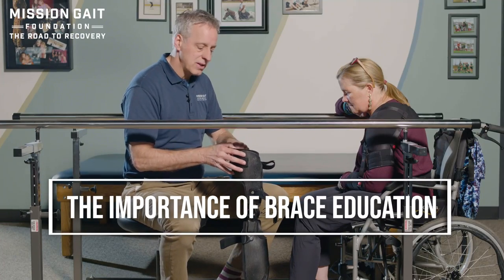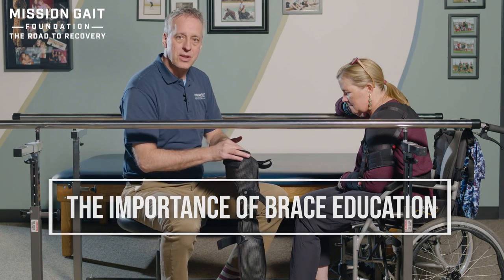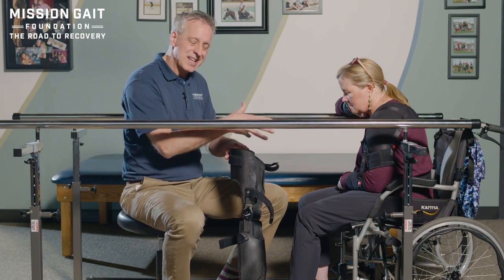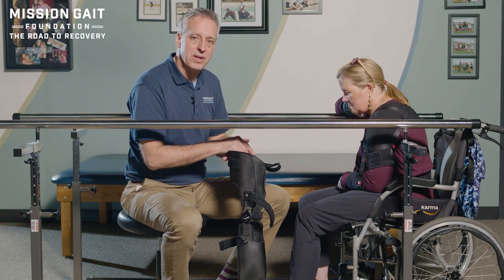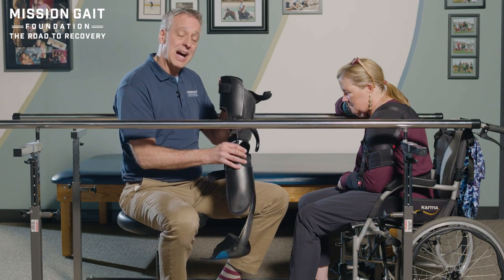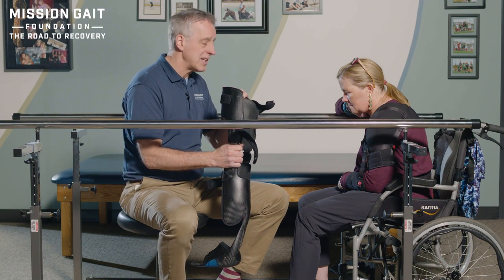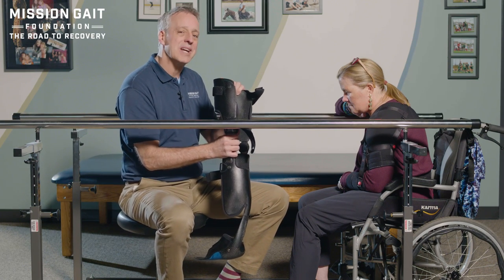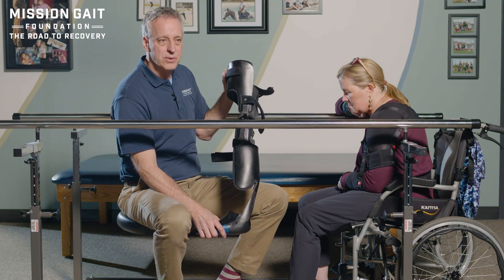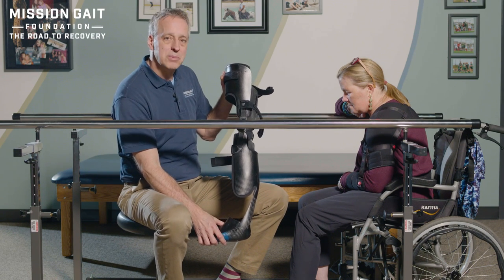I always want to start with a patient describing the technology to them — not just stick a brace on them and have them walk away — but help them understand what that brace is trying to accomplish. This is a very lightweight carbon fiber with a lot of high technology, used in the race industry as well, which gives you good energy return and also good stabilization.